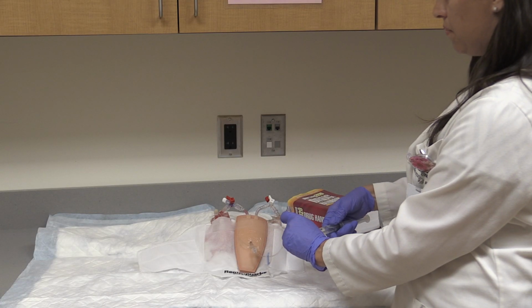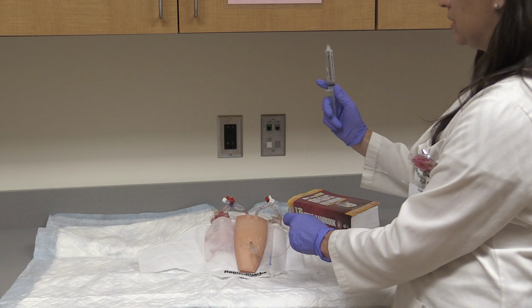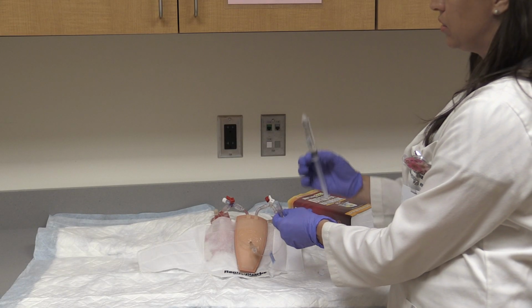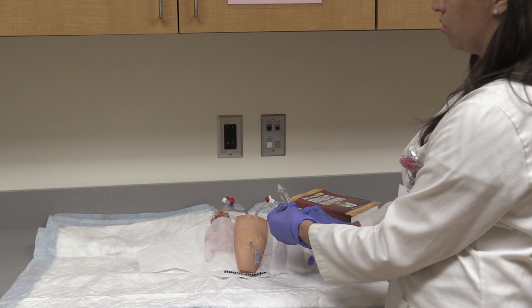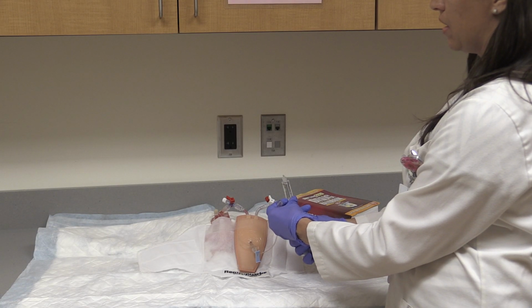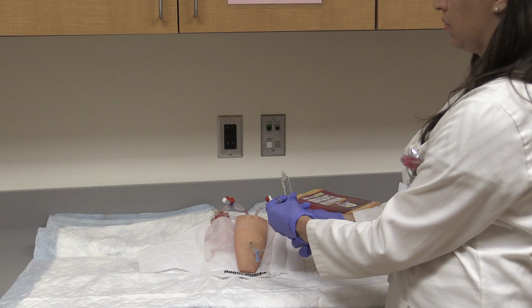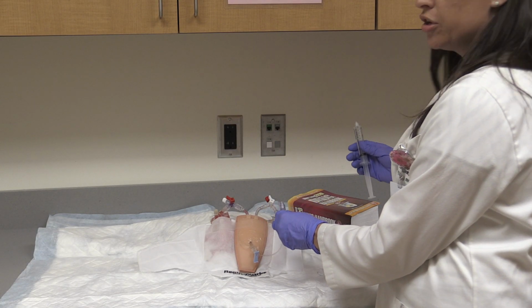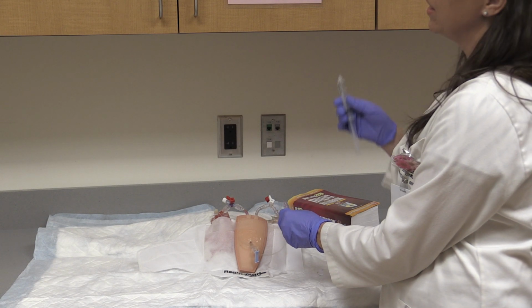And then I'm going to pick up my saline syringe, but you can see that there's air in the syringe, so I need to always make sure I get that air out, because we don't want to inject the patient's vein with air.